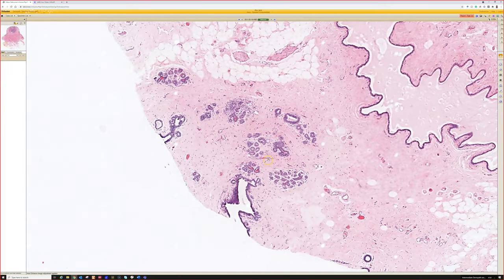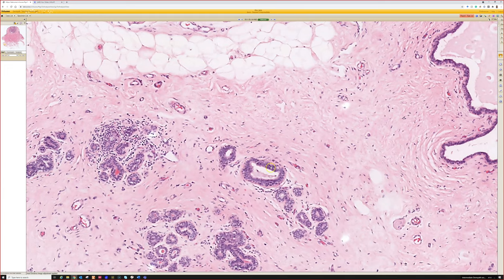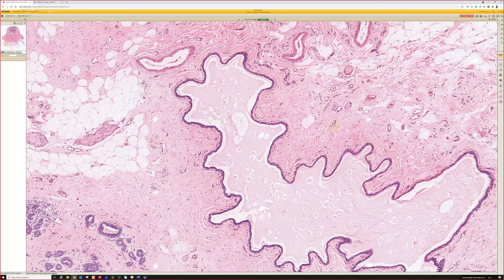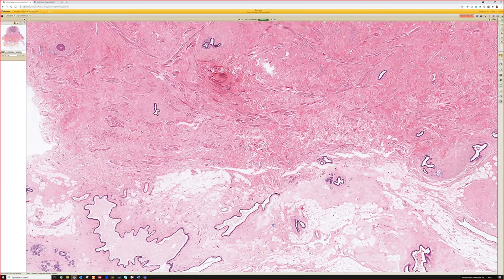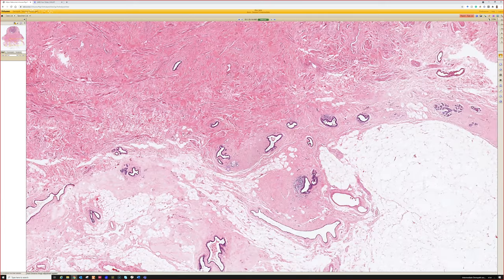This is breast tissue. These little tiny clusters of acini and then these ducts. So these are the lobules and then the ducts of the breast. The ducts look a little bit like sweat ducts, but they have kind of a more columnar lining usually. That's my simplified way of explaining. And remember, breast is kind of like a modified sweat gland, basically, right? So they have a lot of overlap. Here's some cystic dilation of the duct, maybe part of fibrocystic changes of the breast. I'm not sure what the history was.